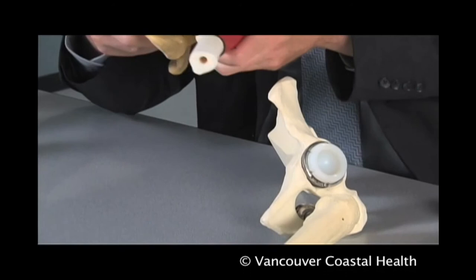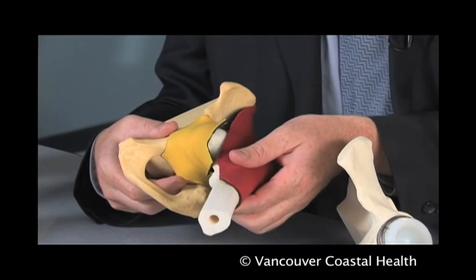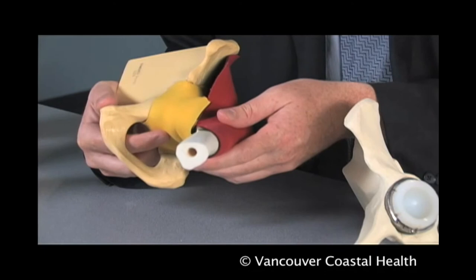Following the procedure, your surgeon will anatomically repair your deep capsule and the ligaments, and reposition the muscle and tension it accordingly so that you can have a good, normal recovery. It's very important that you comply with the recommendations of your surgeon, therapists, and nursing staff, and do not exceed the range of motion restrictions placed upon you in the first few months. Otherwise, you may disrupt the deep tissue repair that has been successfully completed.